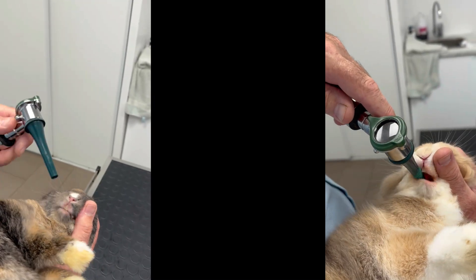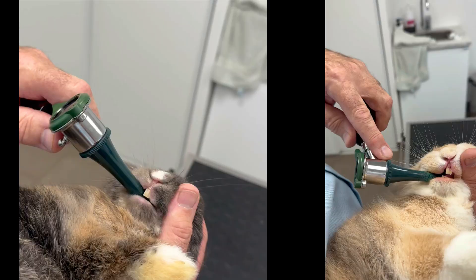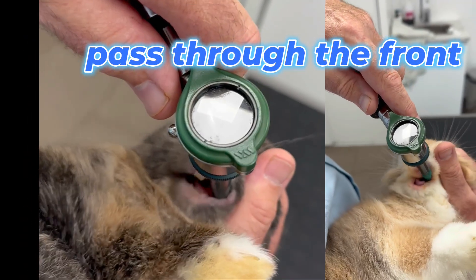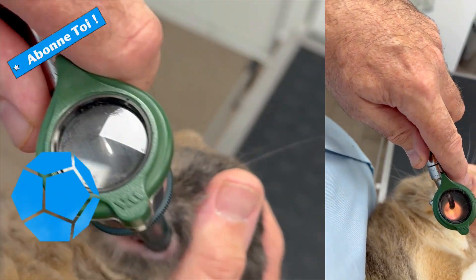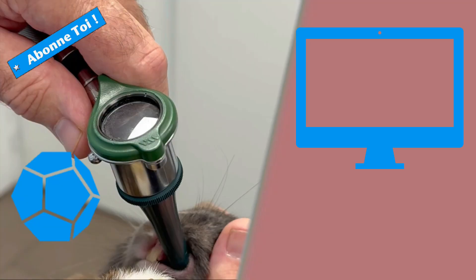His right is on our left. The magnifying glass enlarges the bottom. There you go. And then we move like this to the other side — ready to move to the other side? And there we go. This allows us to see the left side.